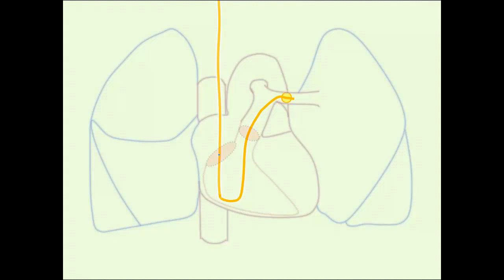So back to my silly little diagram of the pulmonary artery catheter that has been wedged. And again, the first step is you deflate that balloon. Get that balloon down. I don't want any pulmonary infarctions or ruptures because those are very bad. Make you feel very bad. I've fortunately at this point never seen one.